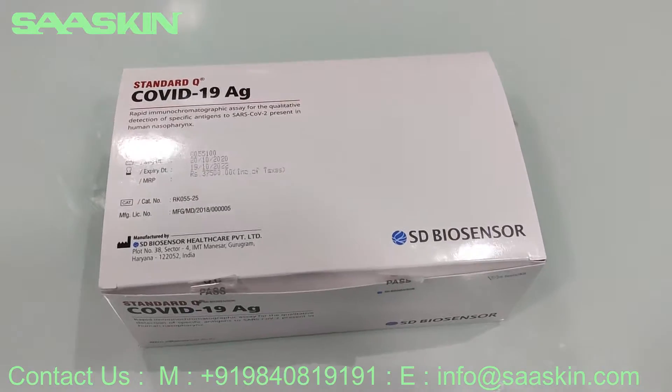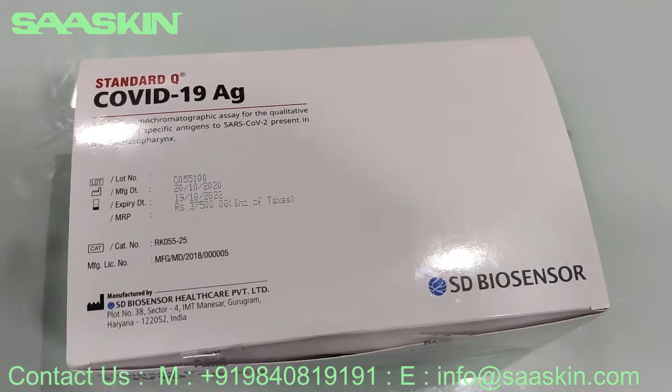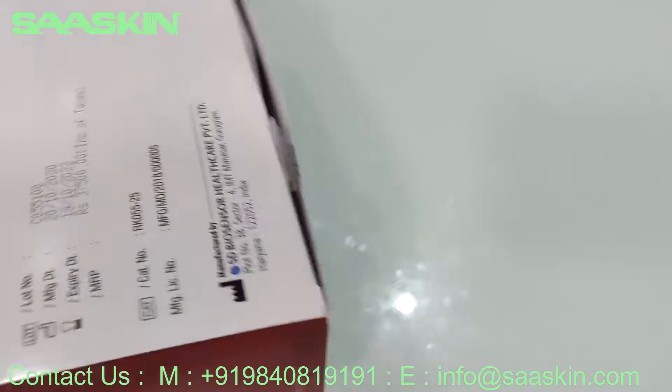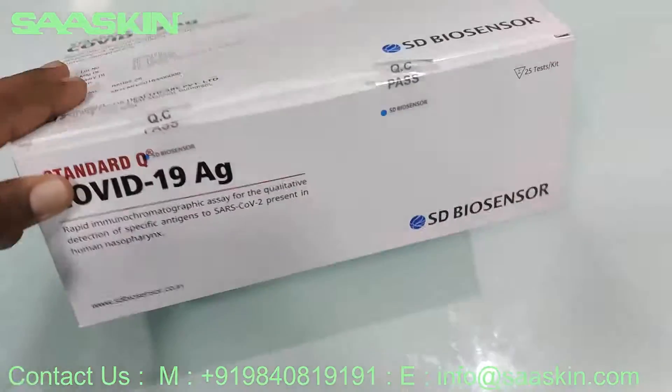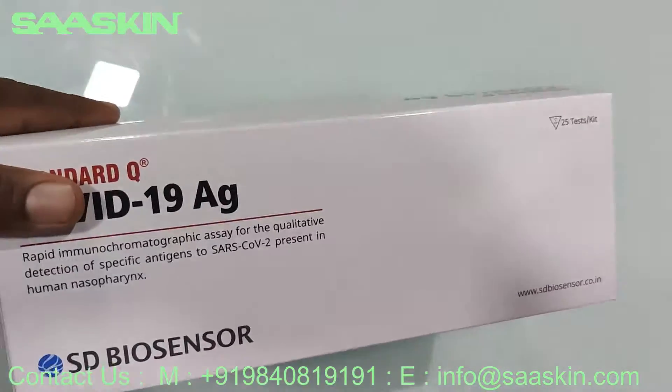Hi, this is a quick introduction video about the COVID Antigen Test Kit box. I'll give you quick details about this box. This is how the box looks from the outside, showing the different sides of the box.